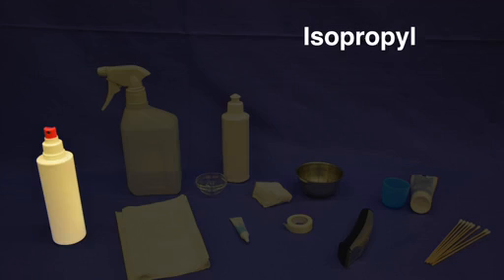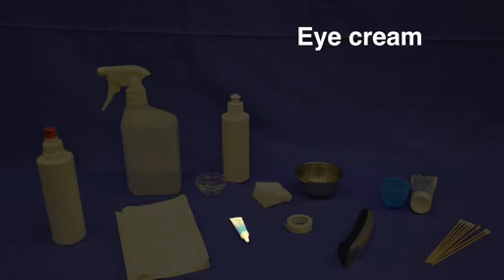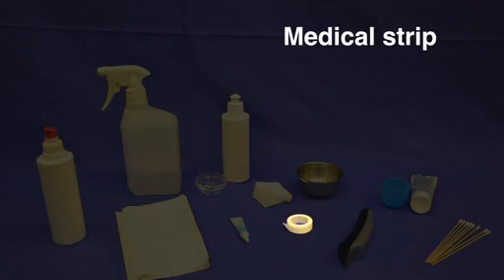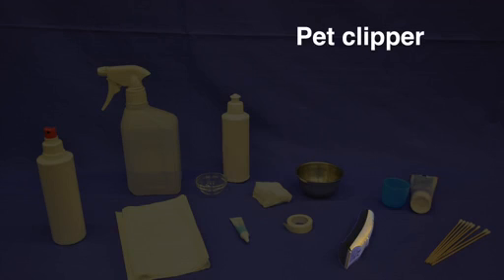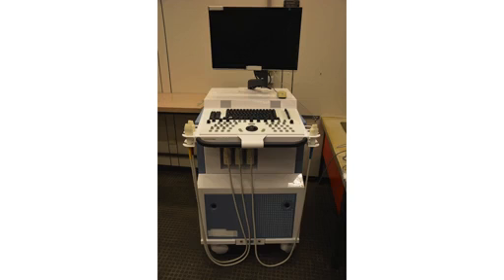In preparation of your ultrasound procedure, the following equipment should be prepared and ready to use. For high-resolution ultrasound, a stationary ultrasound device is used.